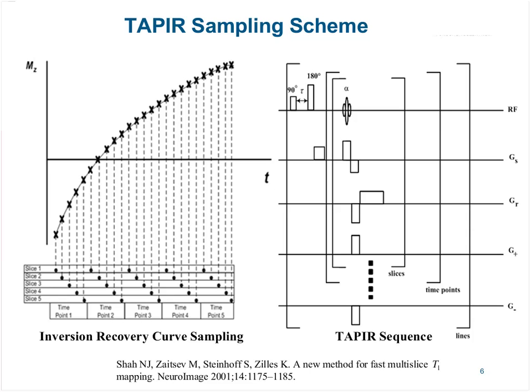Following the application of a 90-degree non-selective RF pulse, the transverse magnetization thus created dephases during the long delay period tau. After this delay time, a non-selective 180-degree pulse inverts all recovered magnetization, and any residual transverse magnetization is spoiled by means of a large crusher gradient.